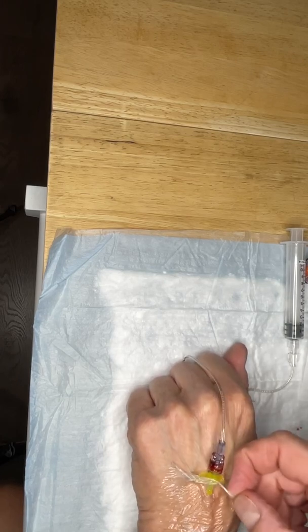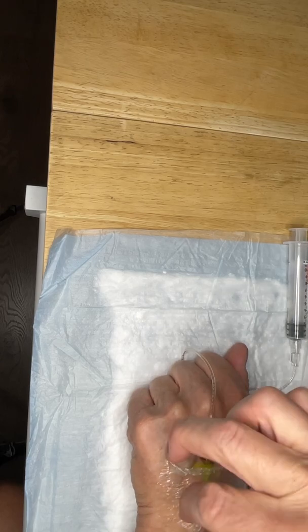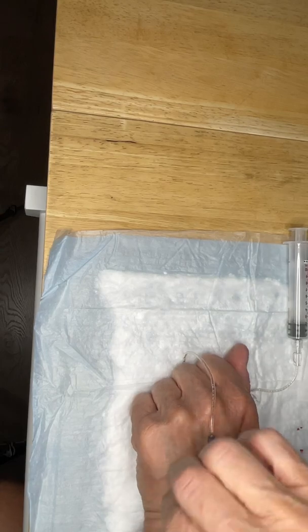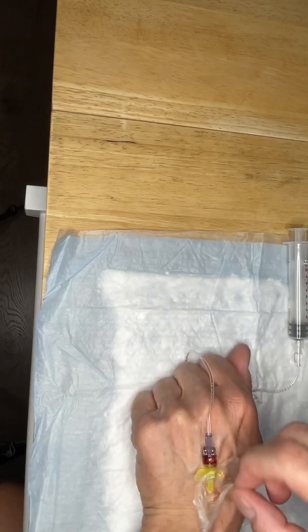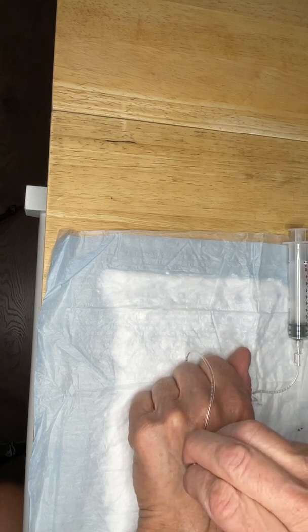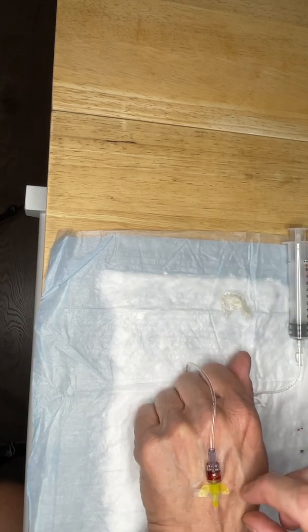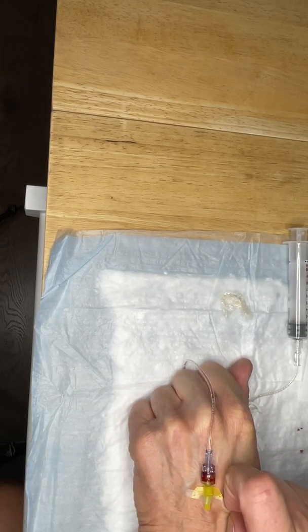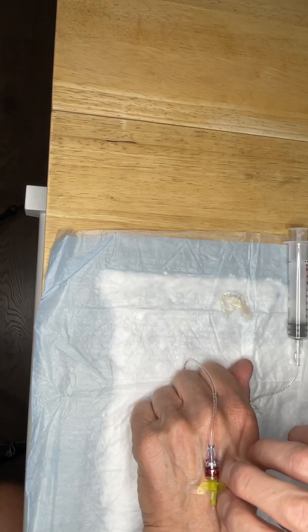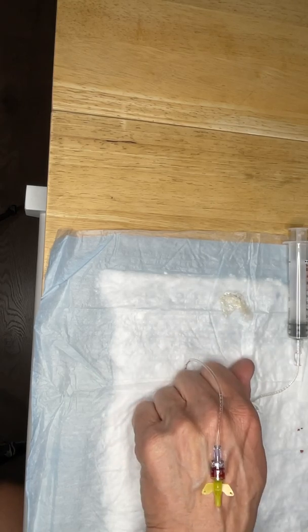Now, taking this stuff off is kind of tricky. We don't want to pull the IV out yet. So we'll get rid of that little piece of tape I have on here. I'm going to tell you a trick.